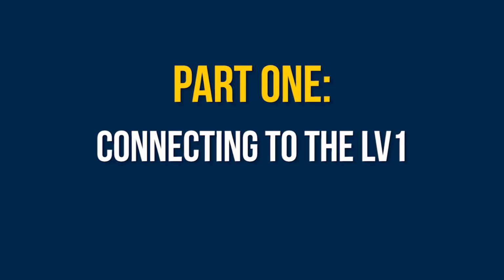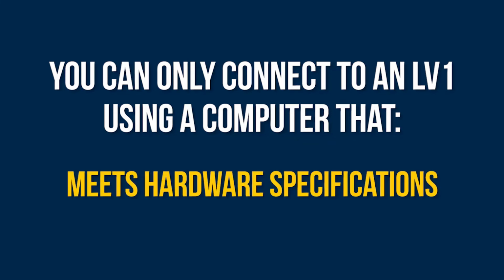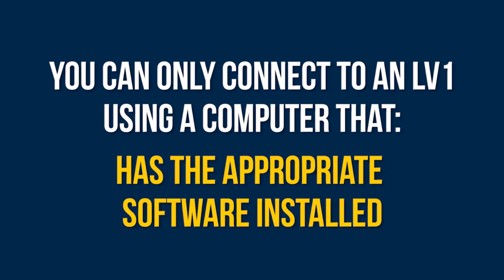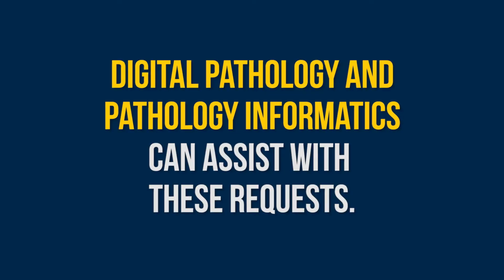Part 1. Connecting. You can connect to an LV1 instrument only from computers that, first, meet hardware specifications as set forth in the approved procedure and, secondly, have the appropriate software installed. For faculty that routinely use the LV1 process, they may request a workstation and monitor that meet current telepathology specifications. Digital pathology and pathology informatics staff will assume responsibility for installing the needed software.